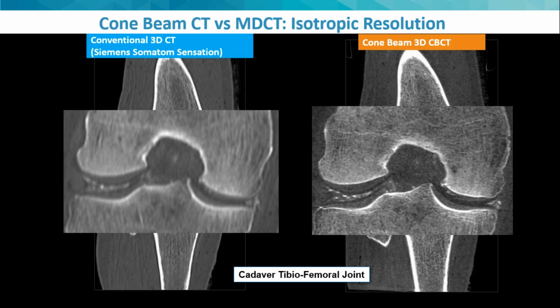You can see it. Go ahead. And then, so thanks. That's really helpful. And then when you say lower absorbed dose, that's something that is somewhat controversial. In other words, when you talk about absorbed dose, are we talking about half the dose, 90%? And I know it varies because there's a huge variation with multi-detector CT. But if I'm doing a knee, can you maybe give me a little bit of an idea of the typical protocol that you would recommend, with your system in comparison to what I might use with my own CT scanner if I were doing a knee?